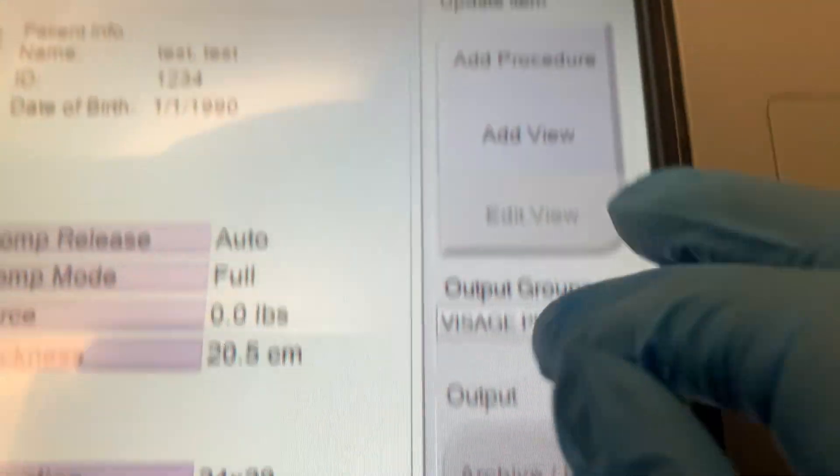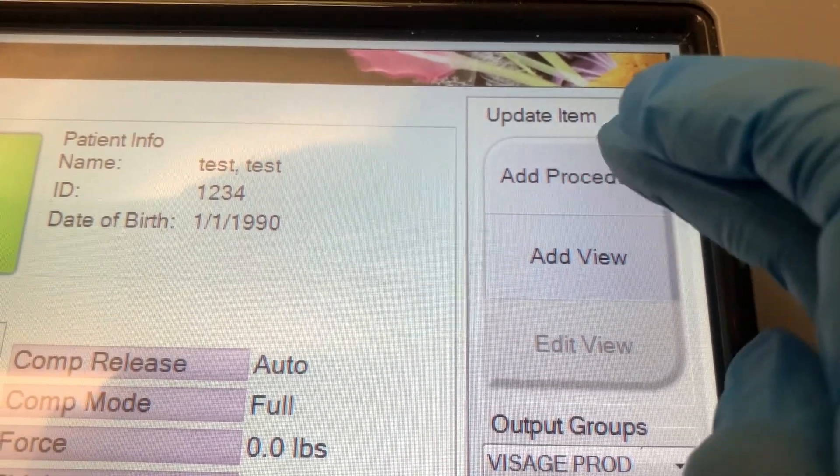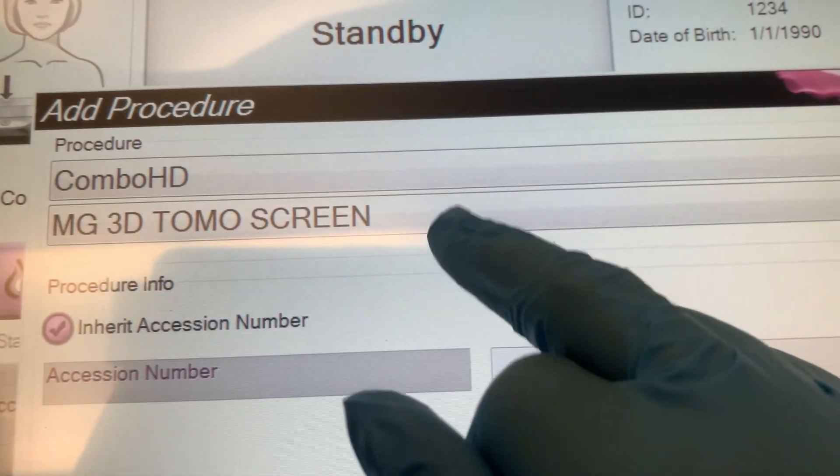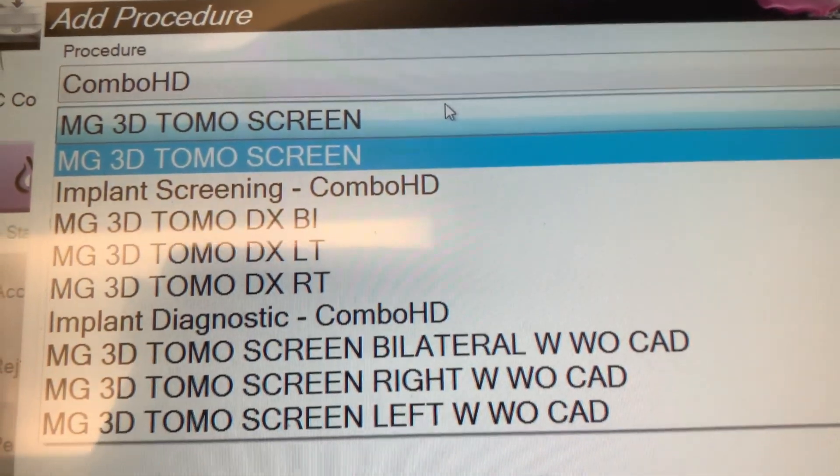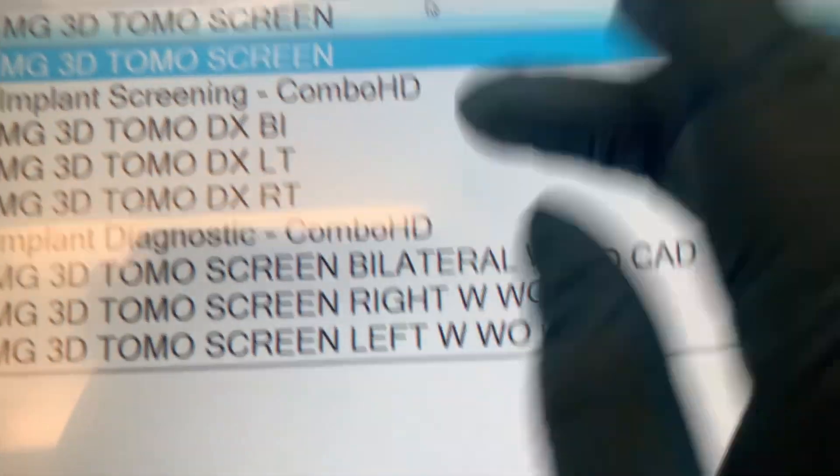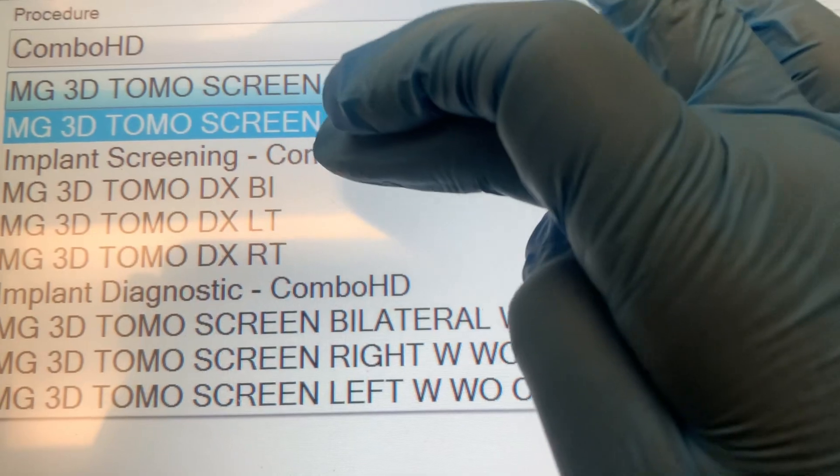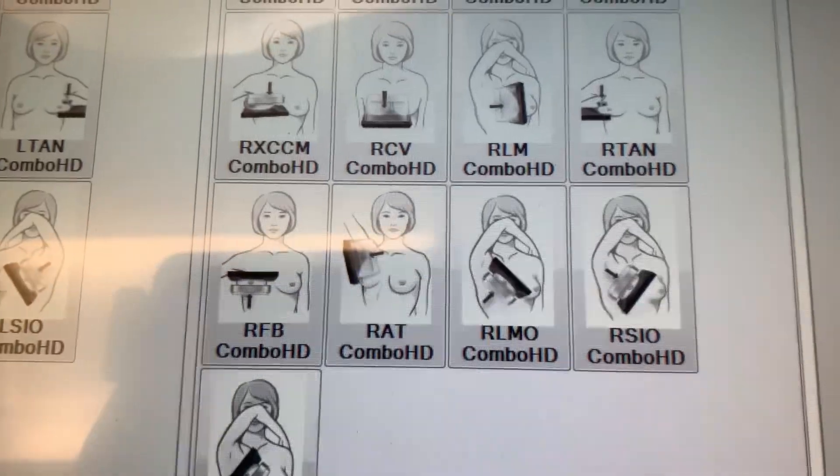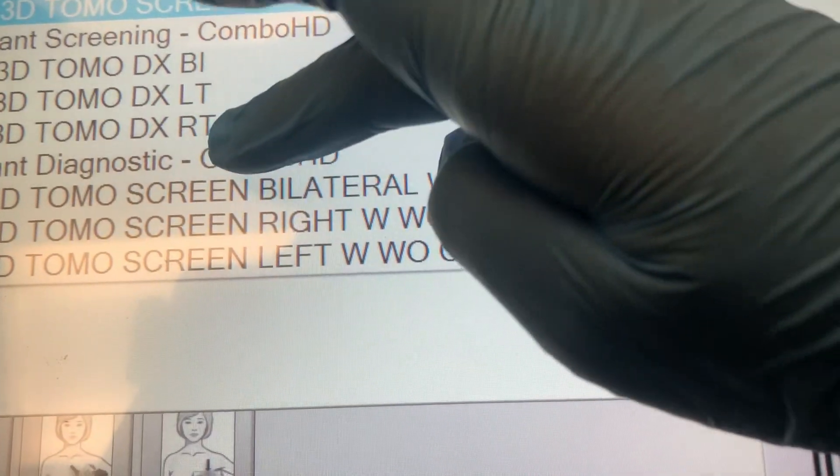And then to add a procedure, like for implants, you can go right there. You can go right there. And then you have different settings. And then I just hit implants.